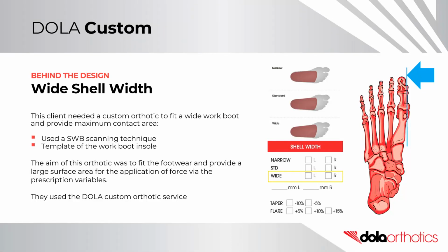Behind the design, wide shell width. This client needed a custom orthotic to fit a wide work boot and provide maximum contact area. They used a semi-weight bearing scanning technique to capture the expanded foot and provided a template of the work boot insole.